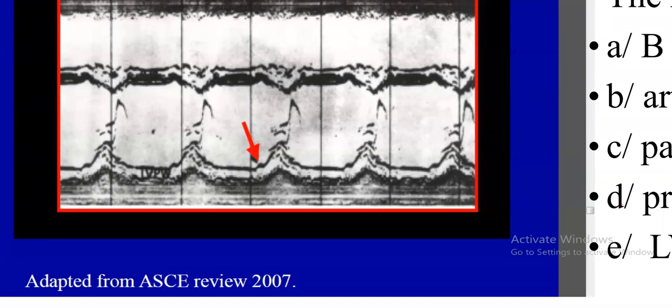So it could be paradoxical. Premature contraction. Not so paradoxical, because you see here, the peak of the posterior wall is almost a little bit delayed. That's no, it could be delayed a little bit. I agree with you. It's delayed a little bit.